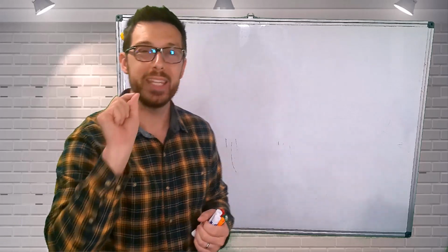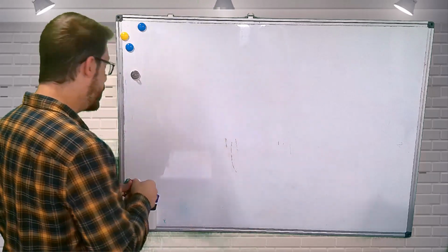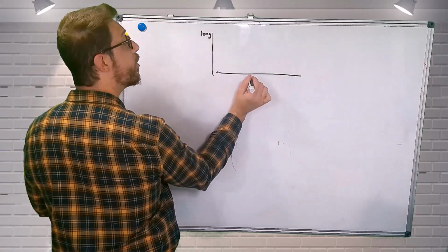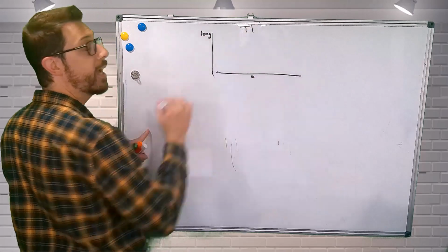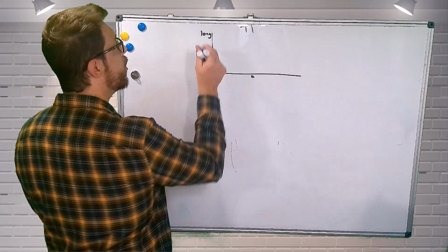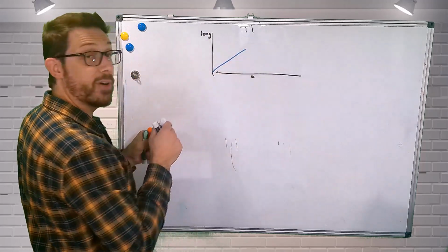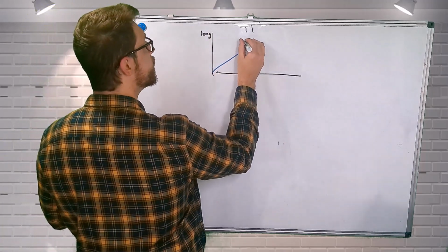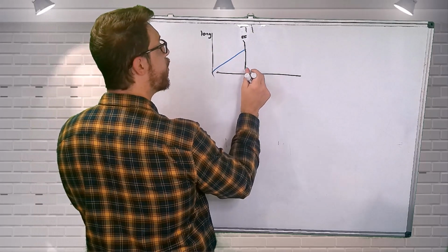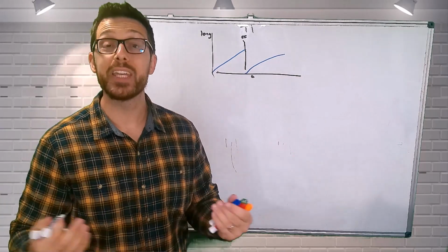And in order to understand this, we need to understand this T1 component and T2 component. So I'm going to do a quick summary of that. If we go ahead and draw longitudinal magnetization recovering over a period of time, we have T1 contrast. We know that if we excite our patient, we lose our longitudinal magnetization, and over a duration of time it regains, and then we deliver another RF pulse, and this drives down our signal, and we start over, and this happens over and over again until we get this steady state of longitudinal magnetization that we encode in our image.